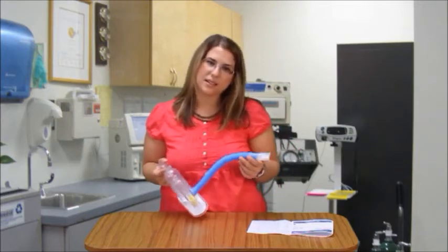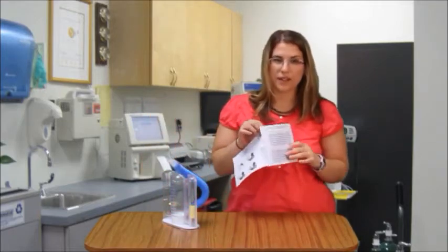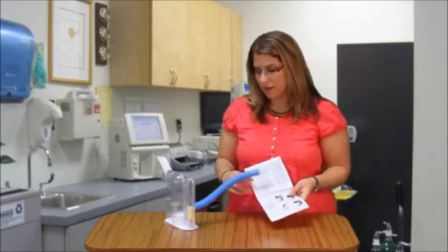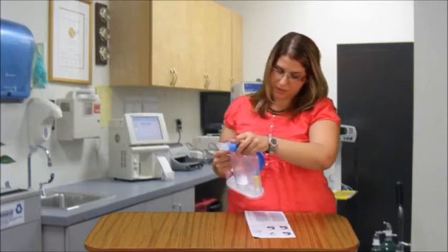We recommend three sets of five. Also, you can find your age-related norms in this little pamphlet. It has a nice chart so you can look up what your normal values are. Right now I just achieved about 2,500 milliliters.